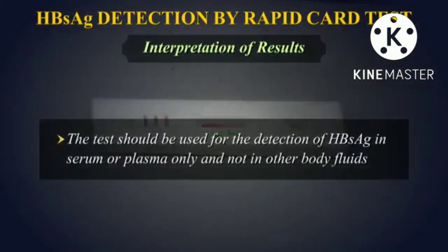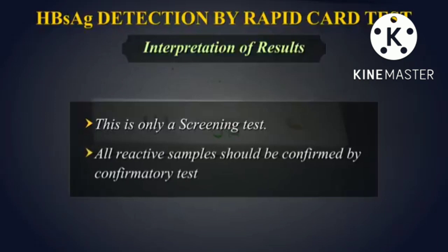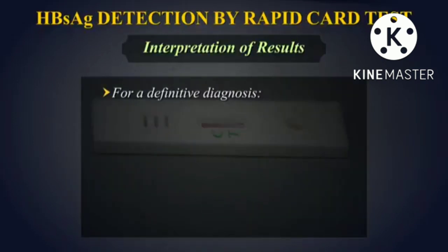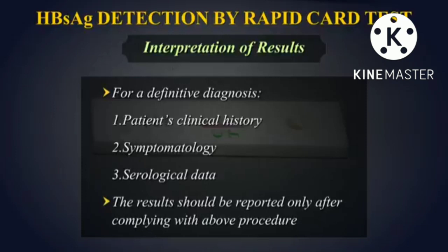The test should be used for the detection of HBsAg in serum or plasma only and not in other body fluids. This is only a screening test. All reactive samples should be confirmed by confirmatory test. Therefore, for a definitive diagnosis, the patient's clinical history, symptomatology, as well as serological data should be considered. The results should be reported only after complying with above procedure.